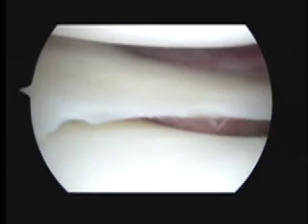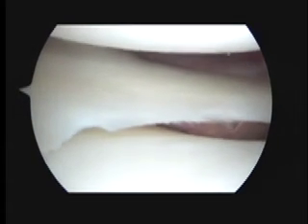But again, not bad. Certainly not as bad as having to reconstruct the ACL. You'll be able to bounce back from this relatively quickly, I would think, because that's, I think, all we have to do. We'll go ahead and put in our shaver and just flush out the knee. The rest of this compartment looks pretty good as well.